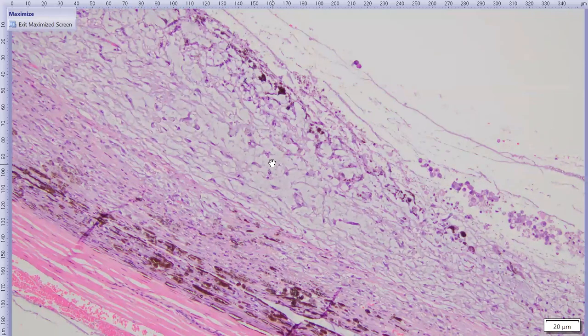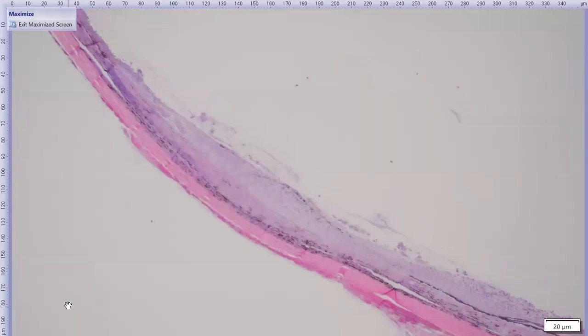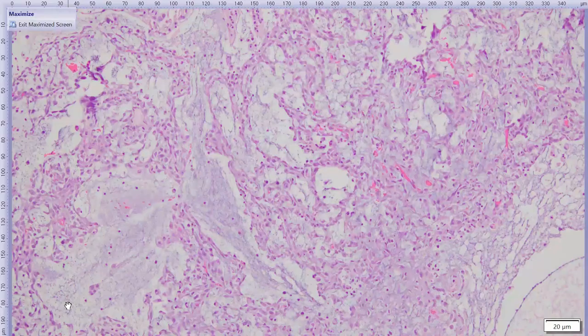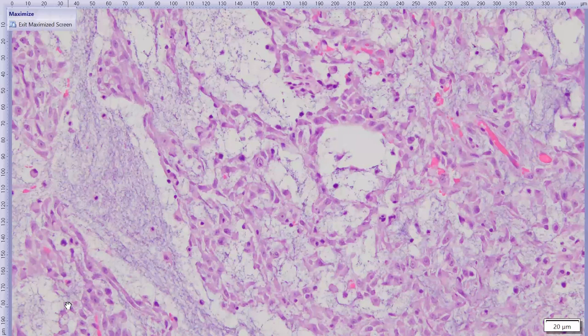We have this sort of pale staining or pale basophilic material that is surrounding these cells in a lot of sections. So they're making a sort of myxoid or mucinous material or surrounded by it. And we have a similar situation back here with the same sort of material that these cells are surrounded by. And then here, although the cells are probably a little bit necrotic and starting to lose some of their detail, they're showing off a lot more of that sort of spindle to stellate morphology rather than the rounder morphology that's up front. So definitely a really weird neoplastic population.